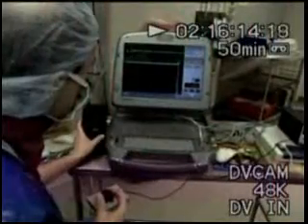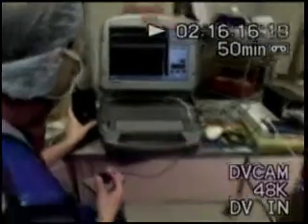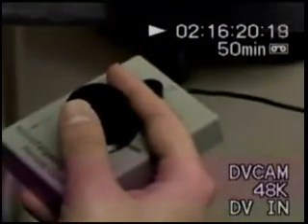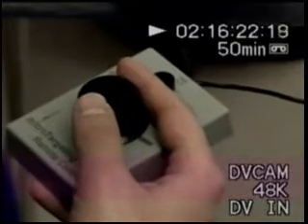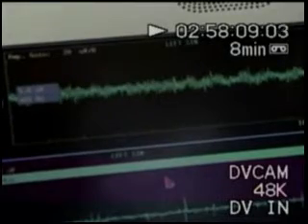we need to be sure that the electrode is in the correct place. So you will first see me using a machine that looks like a video game joystick. And what I'm doing with that is slowly lowering the electrode through different parts of the brain. So that in my right hand is that joystick. And as I roll it, the electrode goes very slowly into different parts of the brain.